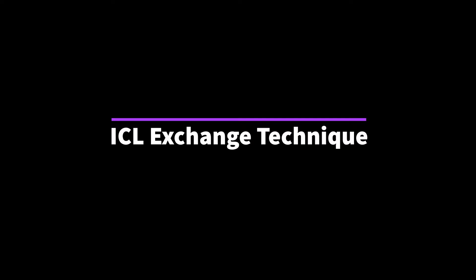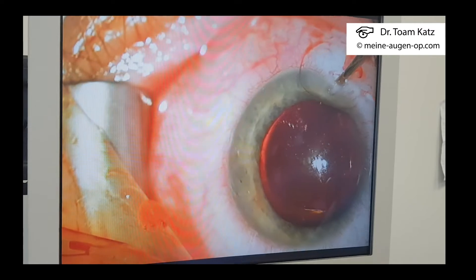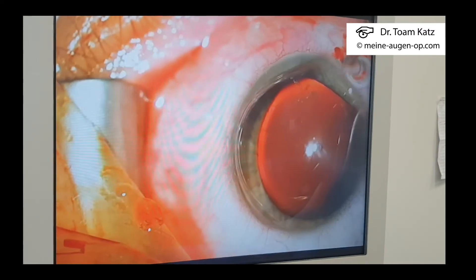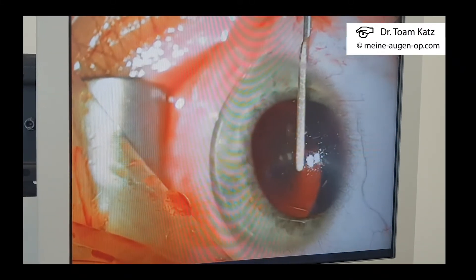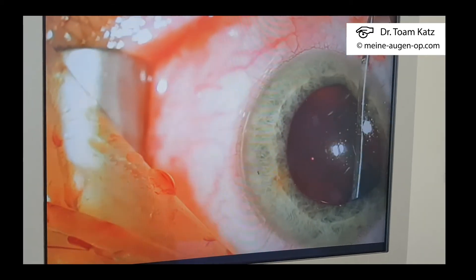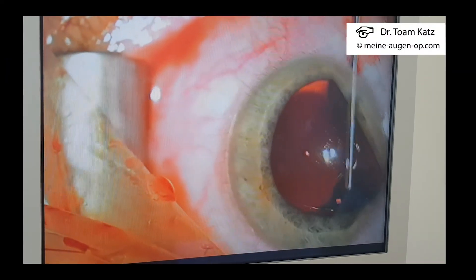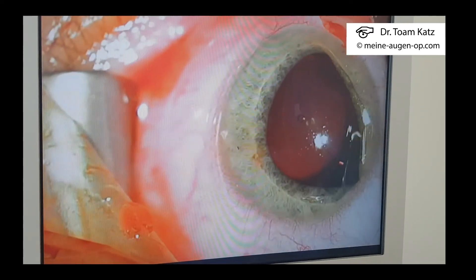I will show you the ICL exchange technique. First, through a paracentesis we inject viscoelastic, and then we use a spatula to lift only one haptic of the ICL above the iris. We do not have to free the whole lens, we do not have to rotate the lens, we do not have to lift all four haptics — one haptic is enough. And it can be done slowly and carefully with enough viscoelastic.